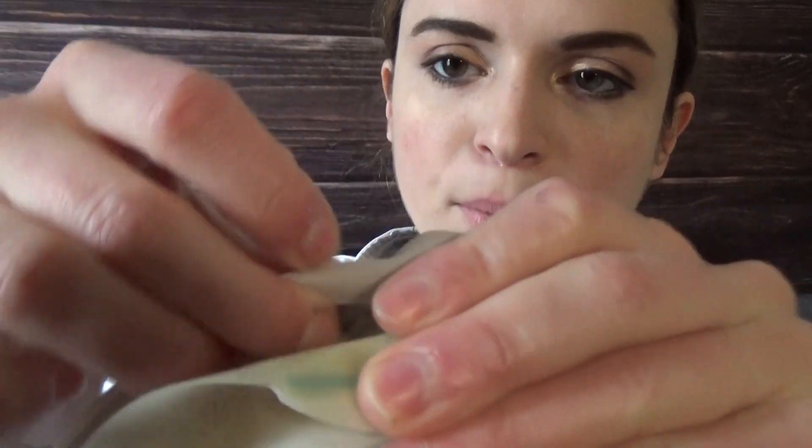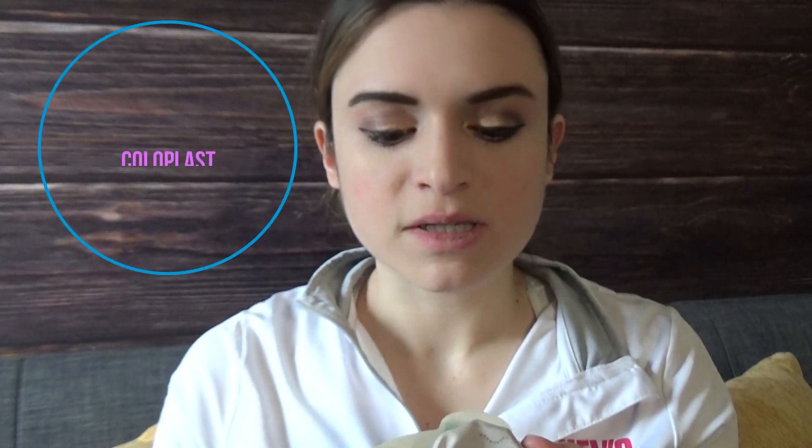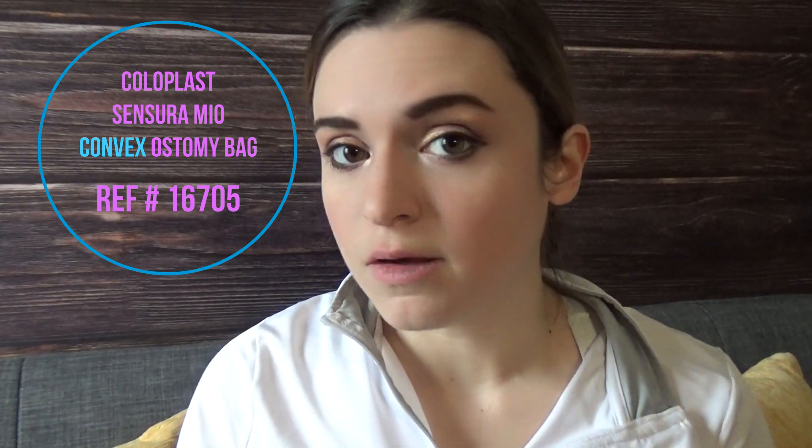I'm going to show you a cool tip I learned from my ostomy nurse. I had thrown away all the boxes my bags came in and really wanted to know the reference number for those specific bags. She told me that Coloplast does something really cool: if you lift up the interior flap, it has the reference number printed on the inside of the bag. The reference number for this specific convex Sensura Mio bag is 16705. My best bag I've ever used — I can't recommend it enough.